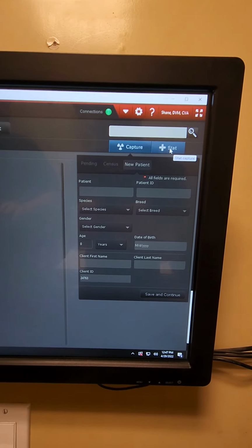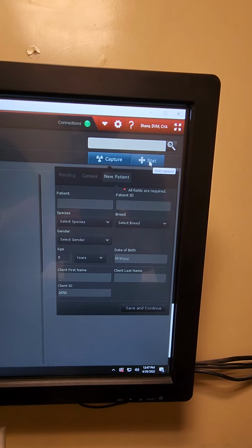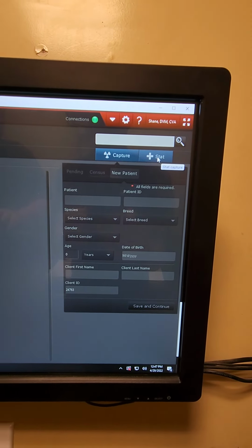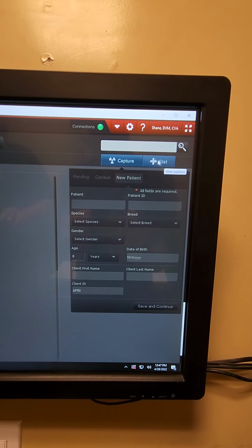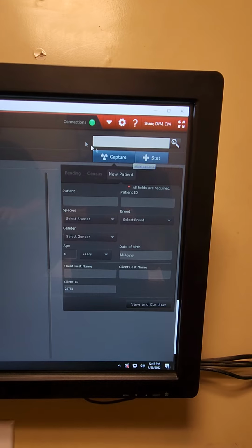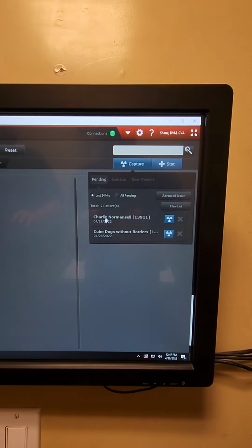And then once you hit done afterwards, once you're done taking all your x-rays, there will be a question at the end of like a patient name, client last name, something just so you can actually identify the patient afterwards. And then you can actually reassign it afterwards, which I'll show you that button later. Right now we can actually take our x-ray.